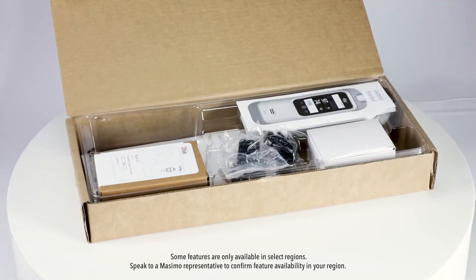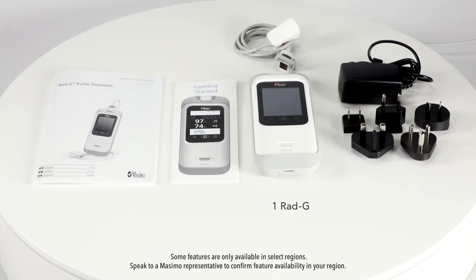In the RadG box you will find the RadG device, one RadG sensor, one charging cable with plug adapters, and a quick reference guide that walks you through the basic operations and setup of the device.